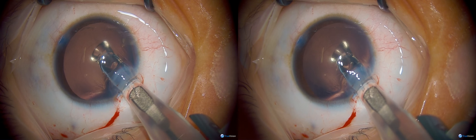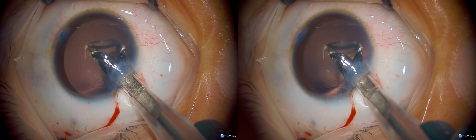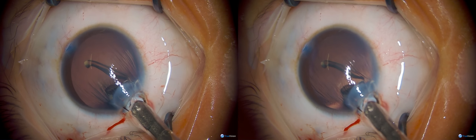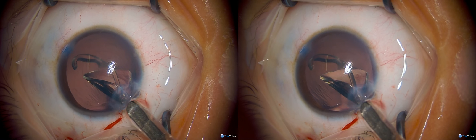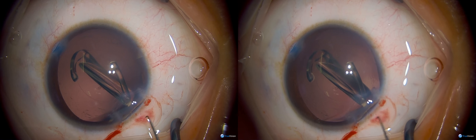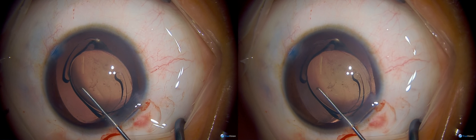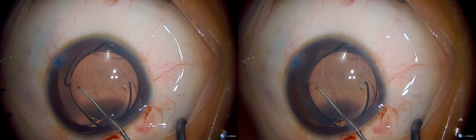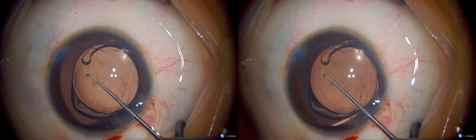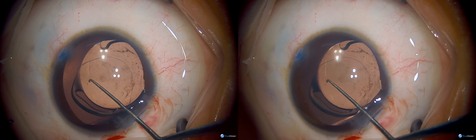Once those two fragments are removed, you can place more viscoelastic in the eye and go back to a repeat injection. Here you can see that the plunger did not extend onto the surface of the optic like it did with the first implantation. Now that pristine intraocular lens can be easily dialed into position. One real benefit of this particular lens for pediatric cataracts is that it tends to open quite slowly, allowing you to maneuver it into position, particularly if you have an irregular capsulotomy.